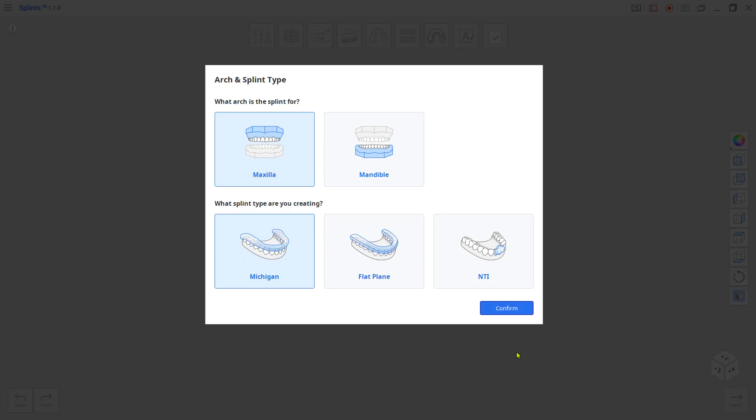Choose the arch and choose flat plane, which is the permissive splint. Compared to the Michigan splint, the permissive splint will allow free movement of the mandible on the contacting surface.